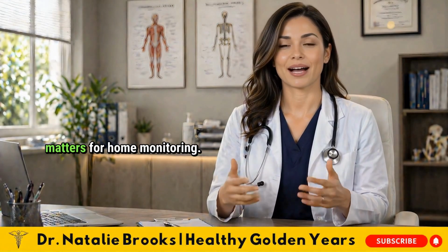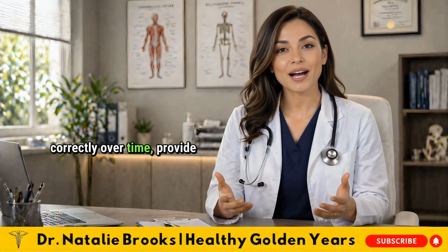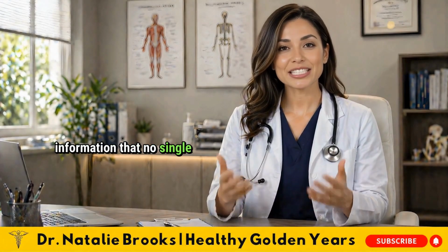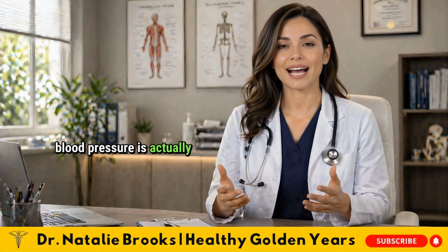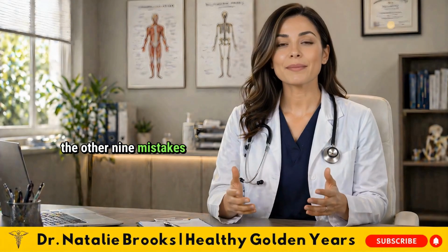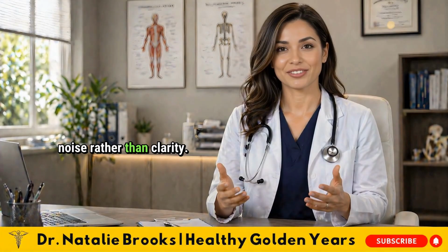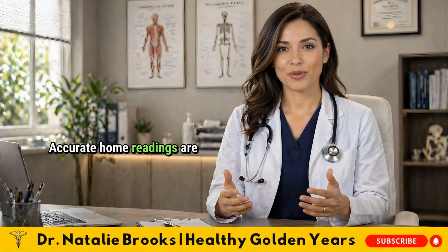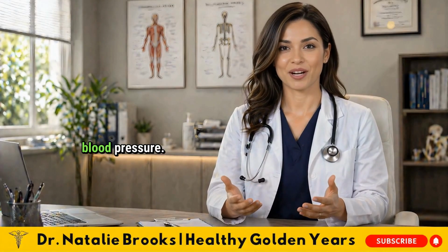Here is why this matters for home monitoring. Your home readings, taken correctly over time, provide information that no single clinic visit can ever capture. They show what your blood pressure is actually doing during your real daily life, but only if all the other 9 mistakes on this list are avoided. Inaccurate home readings add noise rather than clarity. Accurate home readings are one of the most valuable clinical tools available to any patient managing blood pressure.